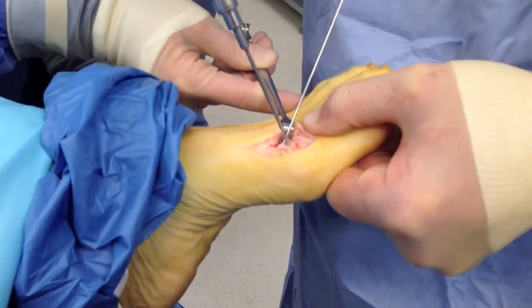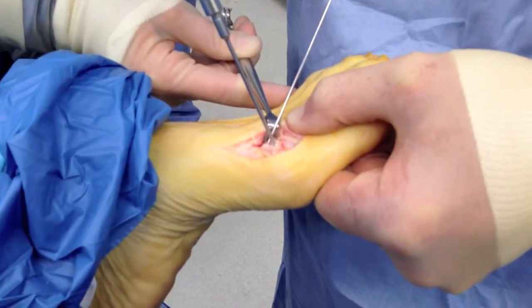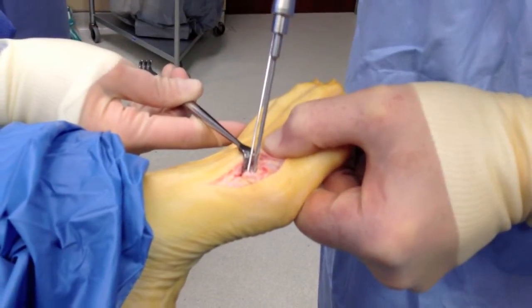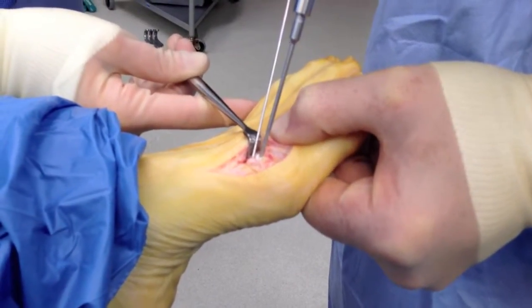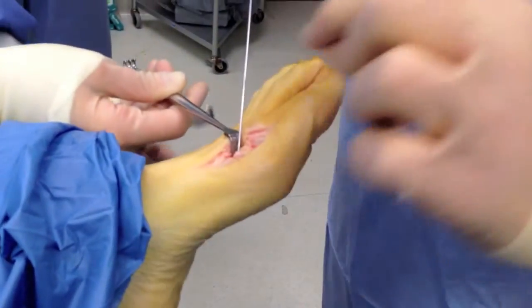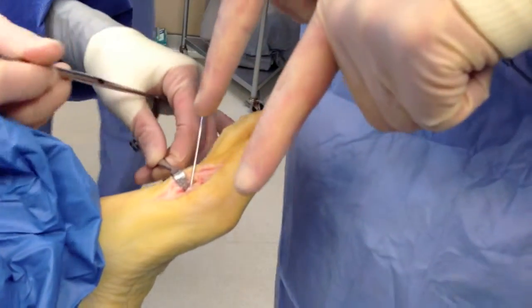Now since these pins don't have threads like a screw, instead of making the second pin parallel to the first, I'll angle it in a little bit. When I angle it, I'll take care of that distraction distally — so it actually won't pull out. The pins are going to come in at an angle like this instead of parallel.